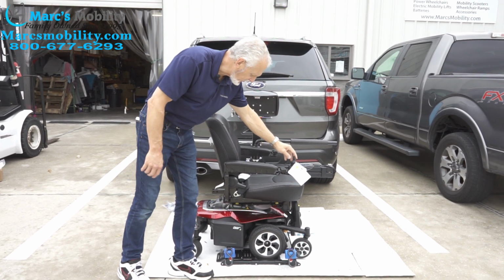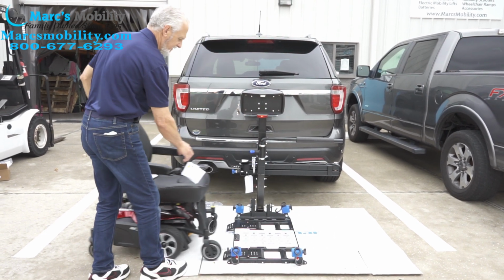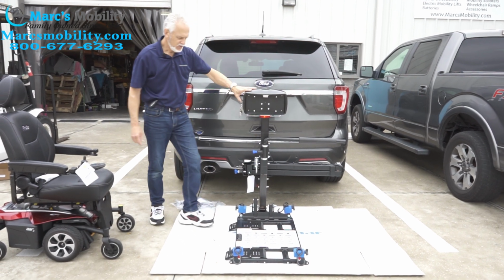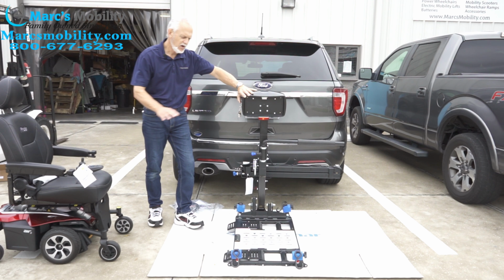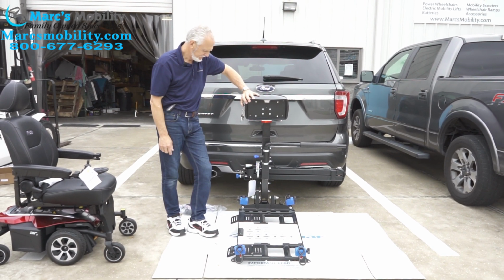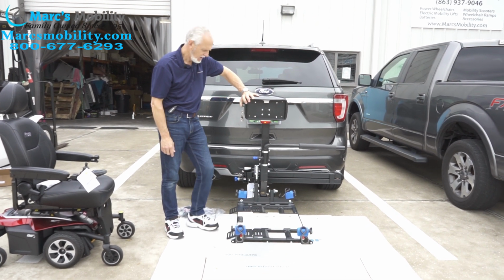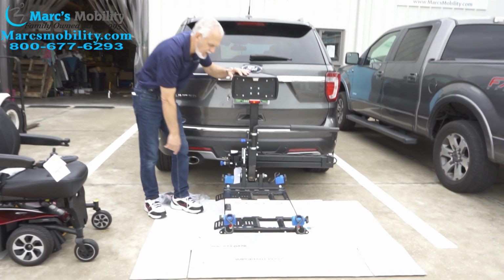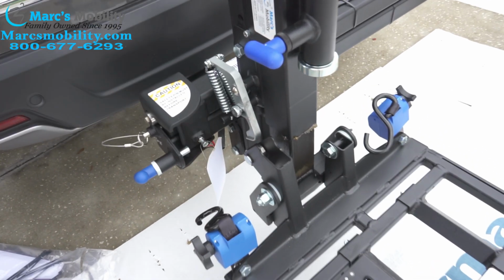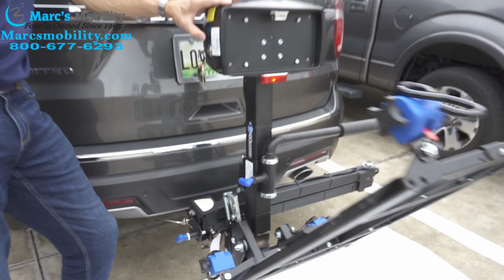I like to go in reverse. I've always done it this way. So this one, you got to help it a little bit because the tires will slide on here. And then when you're done with the lift, the platform will flip automatically. So if you watch over here, you'll see right here the wheel. When this wheel hits the bottom of this shaft, you'll see the platform tilt. And there goes your platform.